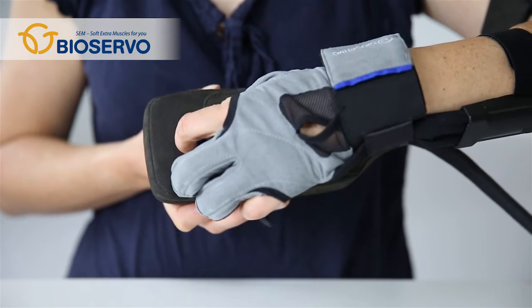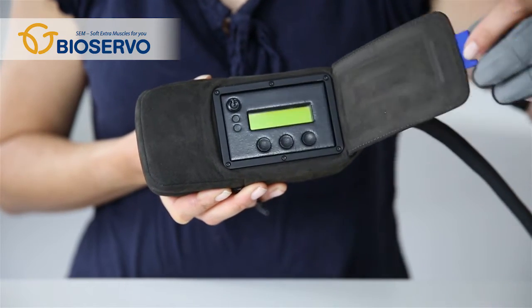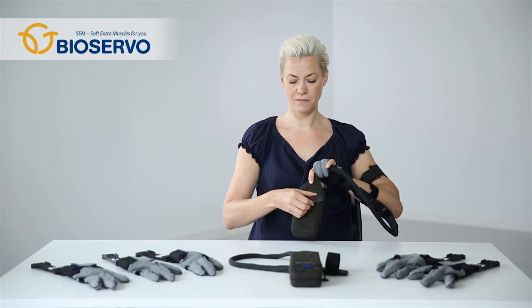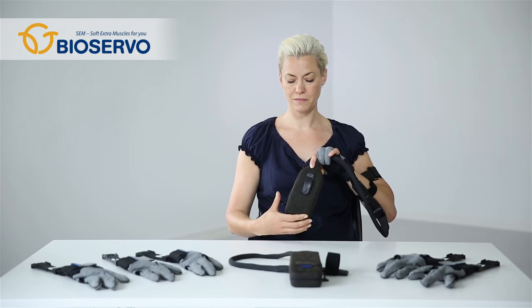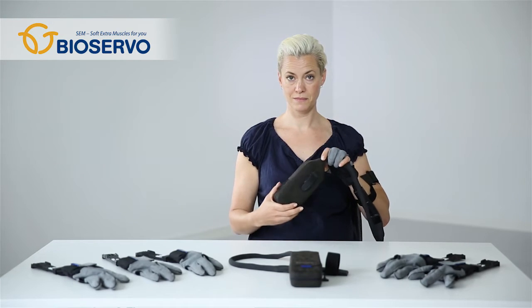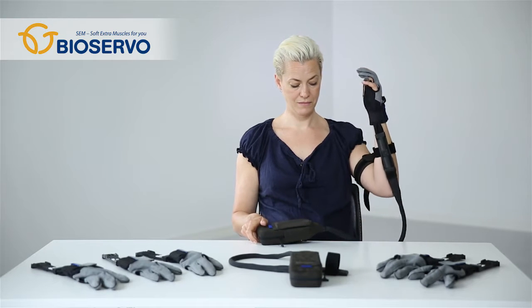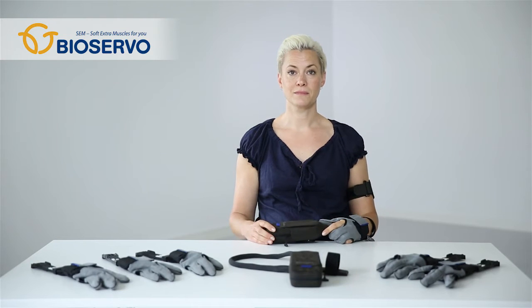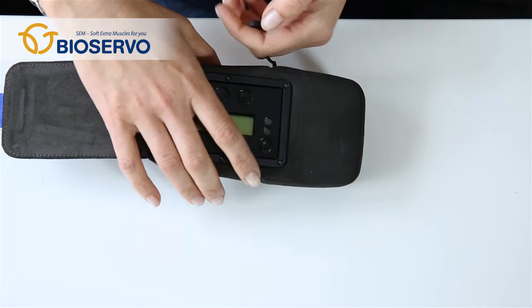You will find the panel where the settings are made underneath the protective cover. The SEM unit is designed to be hooked on a belt, however nothing prevents you from hooking it on other places, putting it on a table next to you, or strapping it onto a wheelchair. A SEM cord connects the control unit to the glove. The cord is available in four lengths depending on the user.